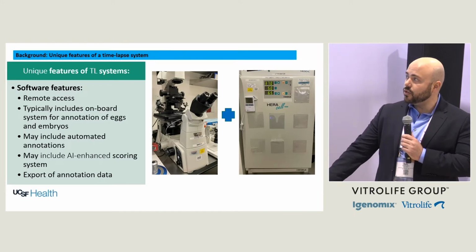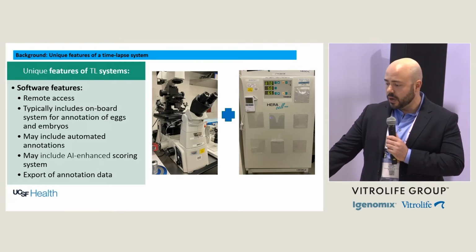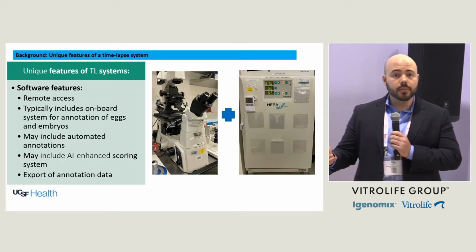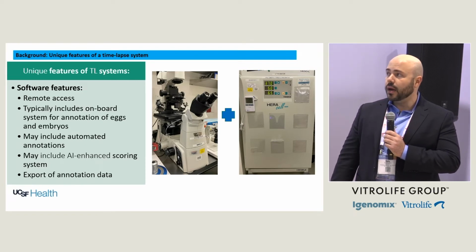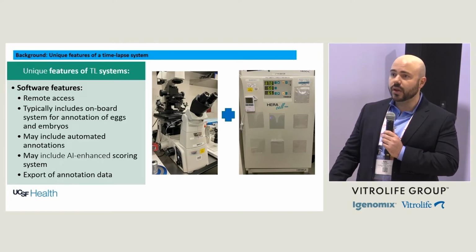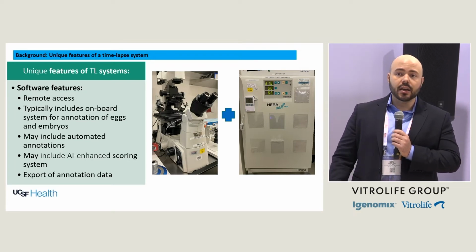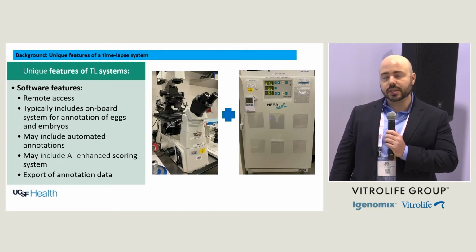So just describing all the types of incubators that I was just listing to you. Now let's talk about a bit of the unique features that the time-lapse system has for you. You can remote into the time-lapse software, so I can see the embryos and how they're being fertilized or how they're growing from my home. During the pandemic, or rather the end of the pandemic, embryologists were able to do great assessments from home. That's something that otherwise we couldn't do before. Or if you only have one fertilization check to be completed, you don't have to go into the lab. You can just visualize the fertilization check online, and because that information is saved, you'll be able to visualize it the next day.